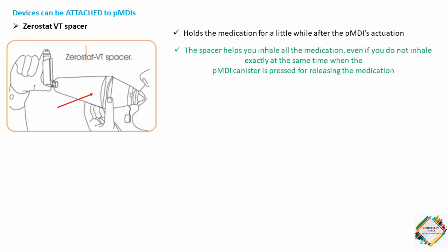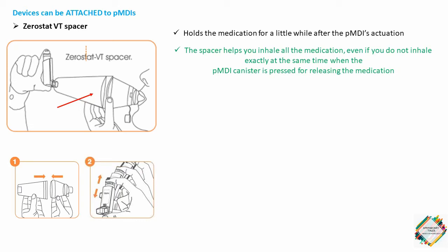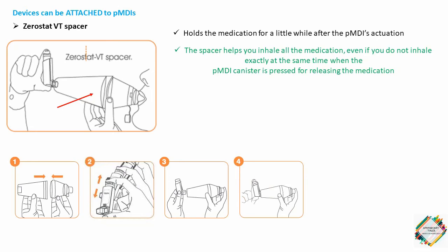To use the Zerostat VT spacer: assemble it by firmly pushing the two halves together and rotating. Remove the cap from the inhaler mouthpiece and shake the inhaler. Insert the inhaler firmly into the opposite end of the spacer. Press down on the canister to release the dose into the spacer. Breathe out fully through the mouth, then immediately place the lips firmly around the mouthpiece to create a good seal — do not bite it. Breathe slowly and deeply, inhaling the medicine through the spacer. Remove the spacer from the mouth and hold your breath for about 10 seconds. Breathe out normally. If a second dose is required, wait one minute and repeat steps 2 to 5.